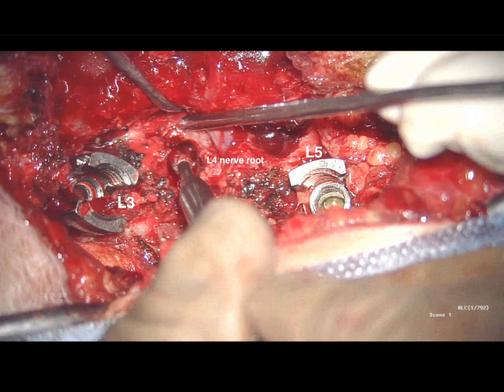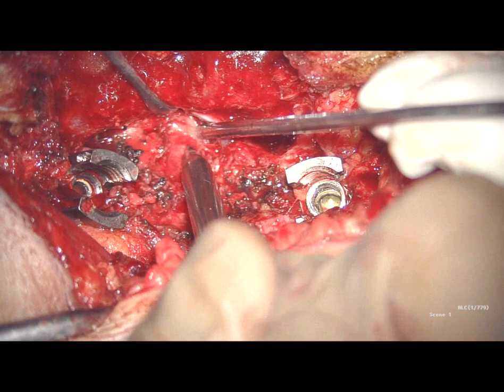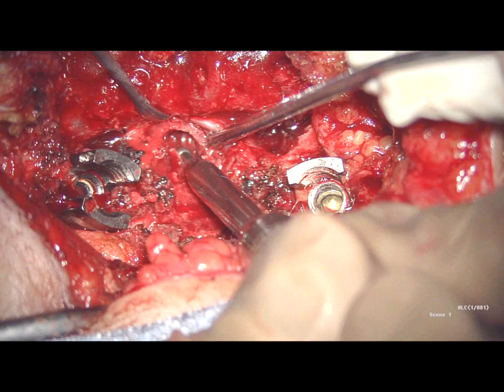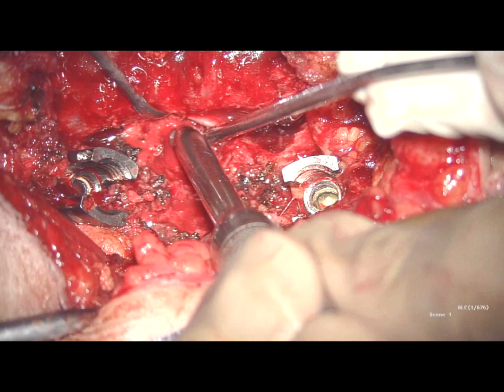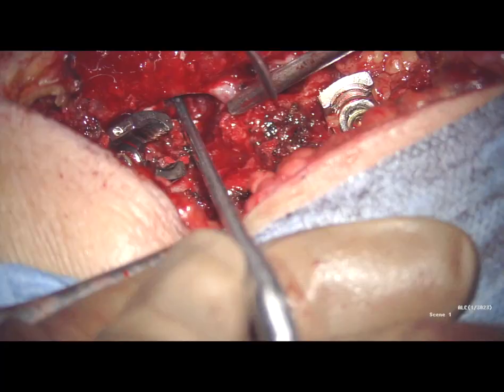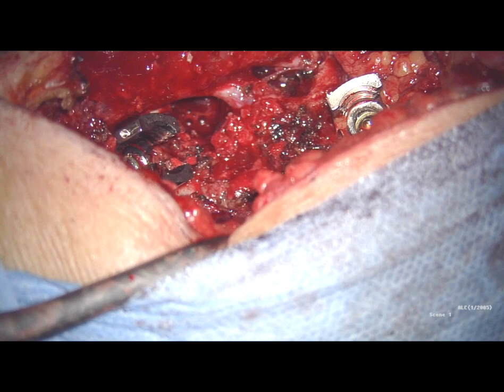The removed L3-L4 facet capsule represents the entrance point of the L4 pedicle. With the use of a high speed drill the bony structures are removed. Care must be taken not to damage the neighbouring nerve root. With rongeurs and punches the L4 corpus is carved from lateral to medial.